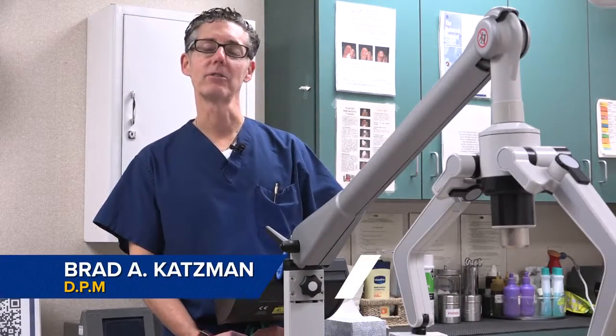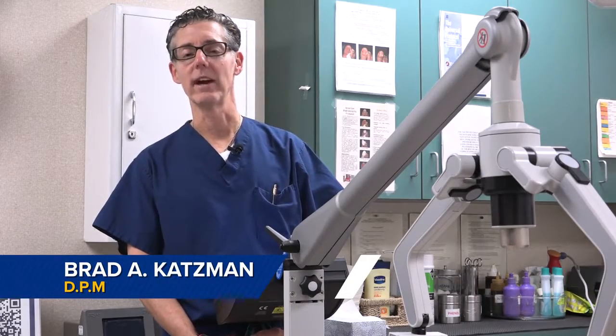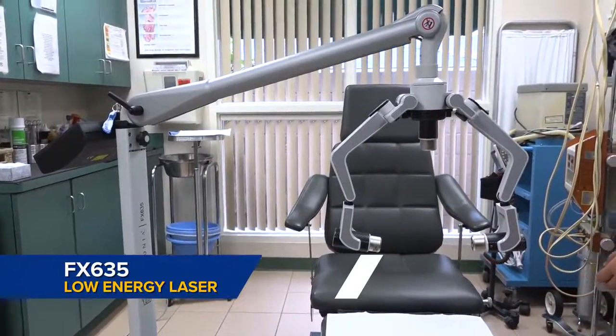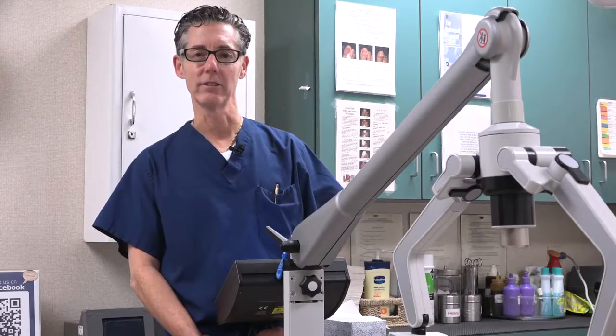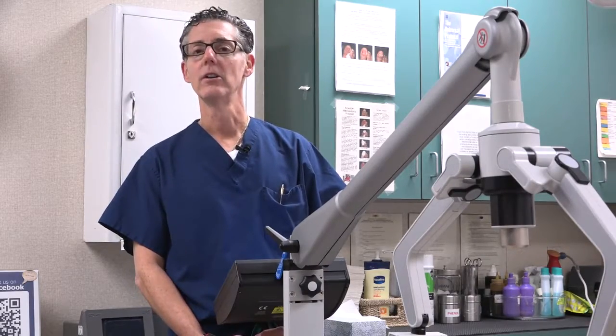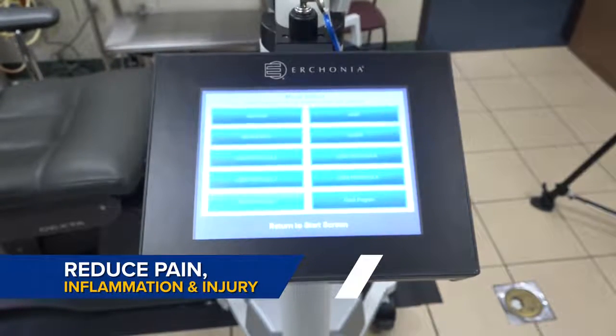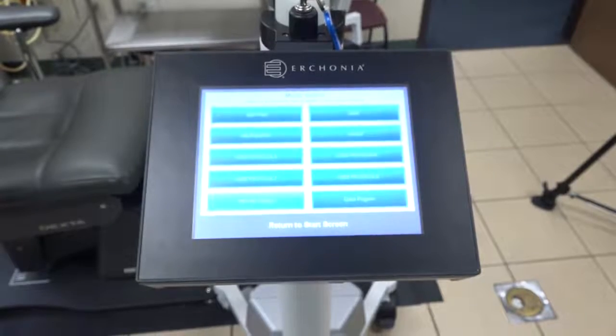At this time we would like to demonstrate our newest laser that we have added to our practice. It is called the FX635. It is a low-energy laser that uses light therapy to reduce pain, inflammation, and injury to various areas of the foot and ankle.